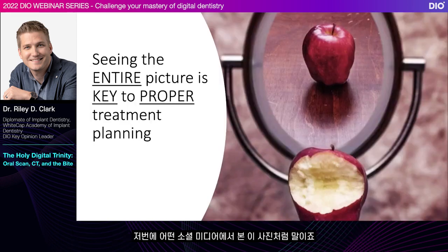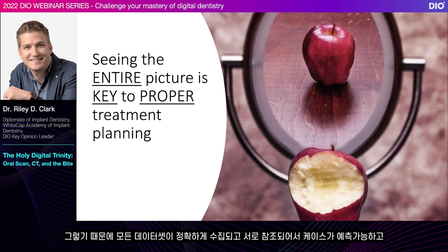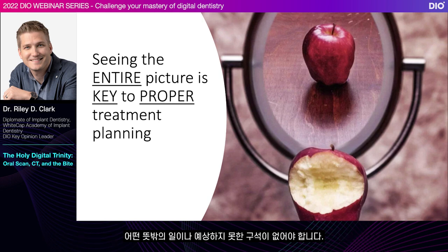Just like this picture that I saw the other day on some social media, it reminded me of digital workflows with 3D analysis. If we only have, let's say, one side of the apple to look at, like the CT scan, but not the intraoral scan, we might be blinded by what the other side of the apple looks like. So it's important that all of these data sets are obtained and accurately referenced to one another so that our case can proceed in a predictable fashion without any surprises, without any hidden corner, just like this apple shows.